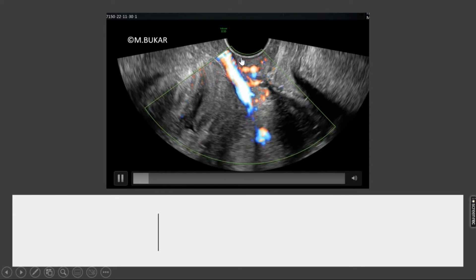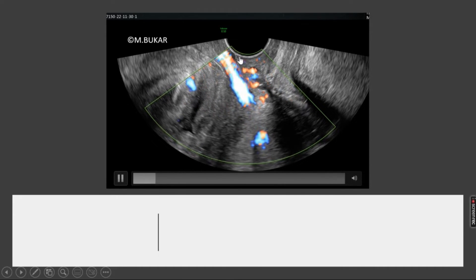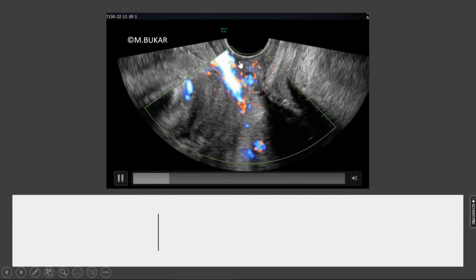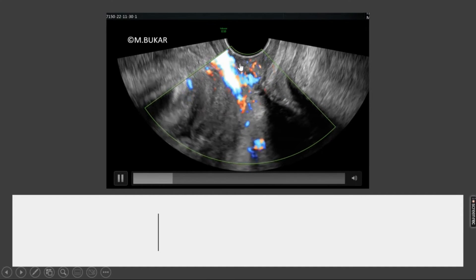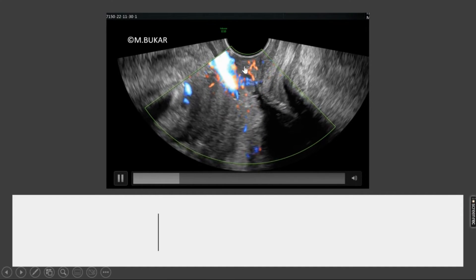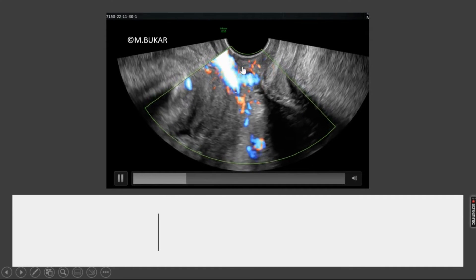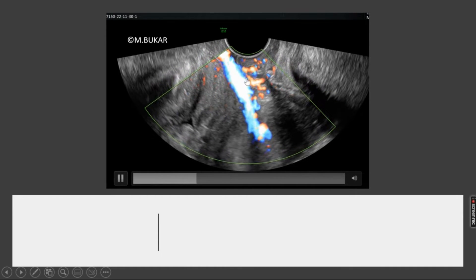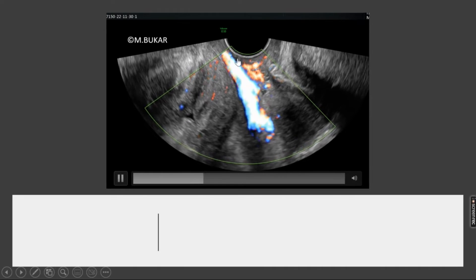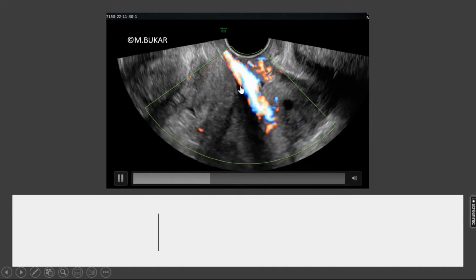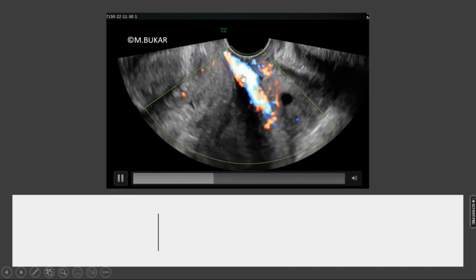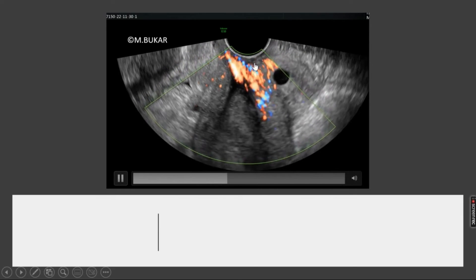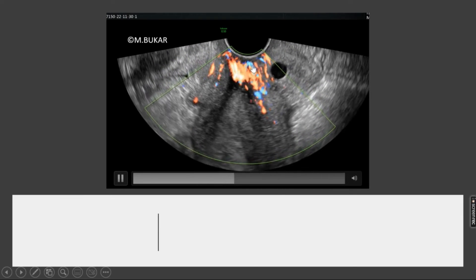Now, the probe is gently introduced into the vagina. As you can see, this is the posterior vaginal wall. You can see fluid within the vagina, and you can see the probe going in up to the posterior fornix.